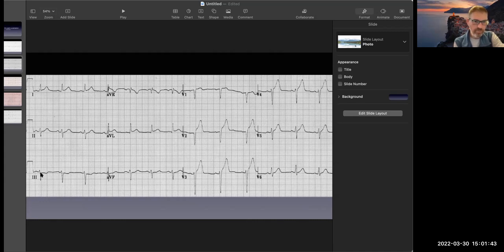So this depression that we see in lead 3, what do you think that might be? What do you all think? Anyone want to? Reciprocal. Yeah, that's more than likely reciprocal change due to the lateral changes. Although it is possible that this could be what we call a wraparound LAD situation, where the LAD is actually perfusing some of the inferior wall. It could possibly be that, or it could be reciprocal changes. Either way, this is a pretty bad STEMI because a large portion of the left ventricle is being involved here.